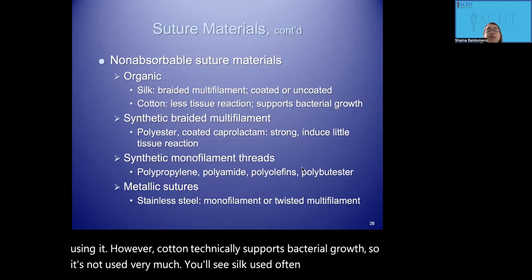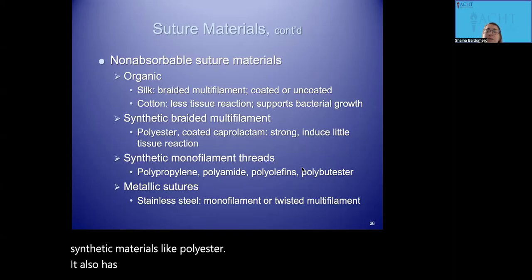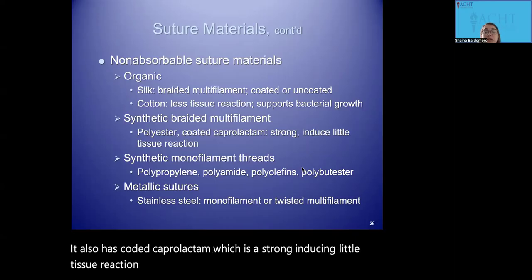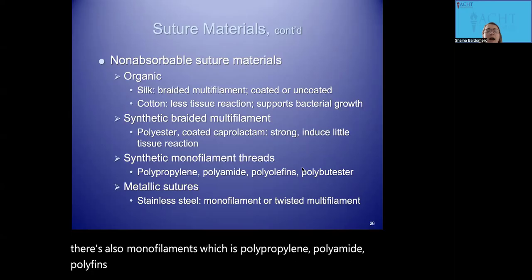You'll also see synthetic materials like polyester. It also has coated caprolactam, which is a strong material that induces little tissue reaction. And those are multifilaments, versus monofilaments, which are polypropylene, polyamide, and so on. Again, just different synthetic type materials.